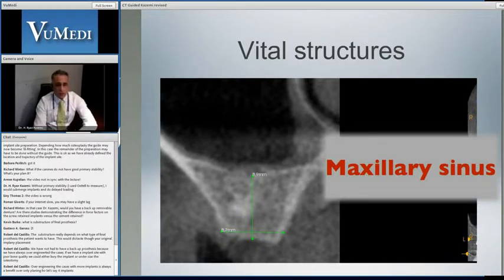And also to give us an idea whether we're going to do the sinus lift and the implant in one stage or two stages. Typically, the guideline that I use is if I have any less than 4 or 5 millimeters of native bone, I do a two-stage procedure, augment the sinus, and then come back for the implant placement 6 months later.